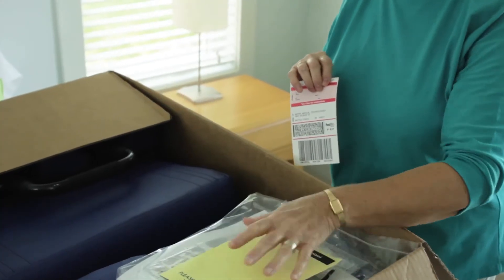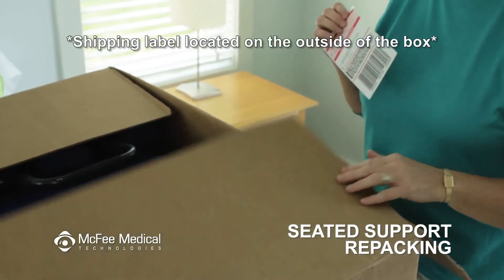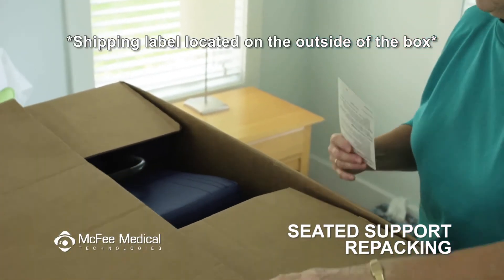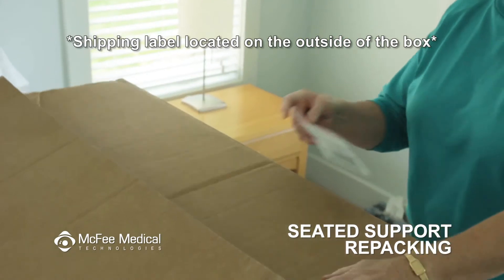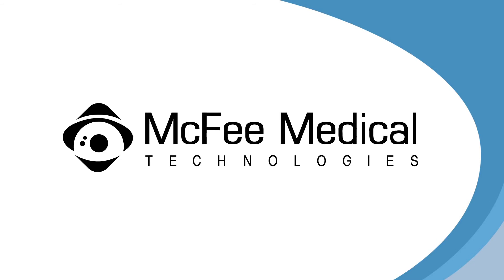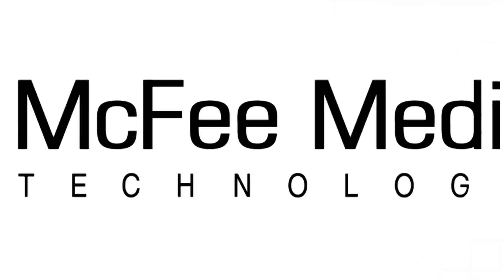After making sure all items are packed in the box, close the box and make sure you have the return label over the original shipping label. Tape it shut using a strong tape such as clear packaging or duct tape. Now it's ready to ship. If you have not done so, call your McPhee Medical customer service representative and they will provide you with final shipping instructions.